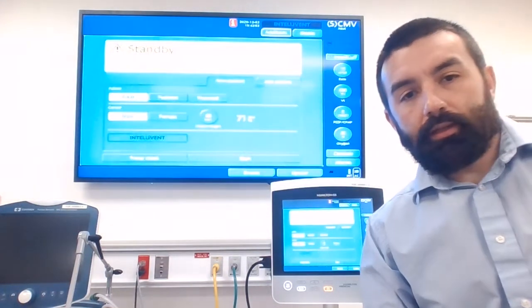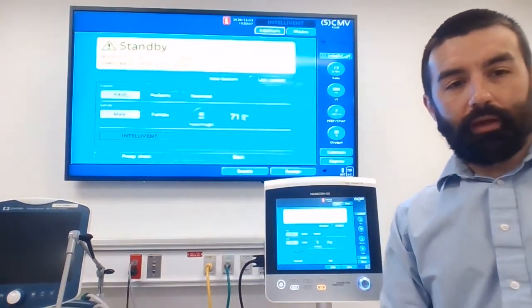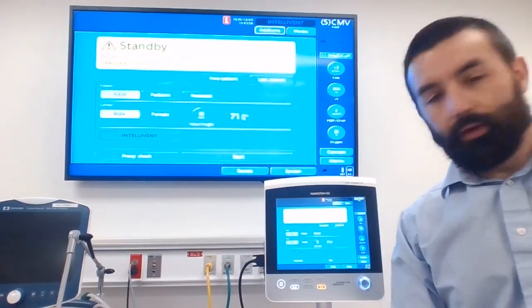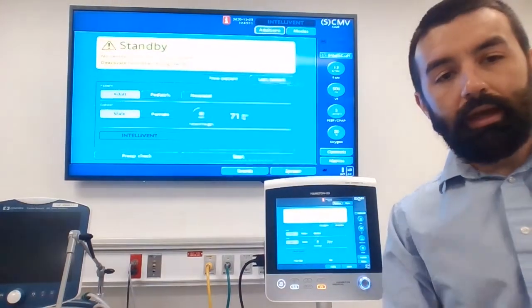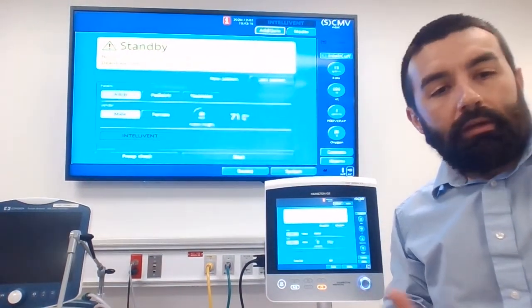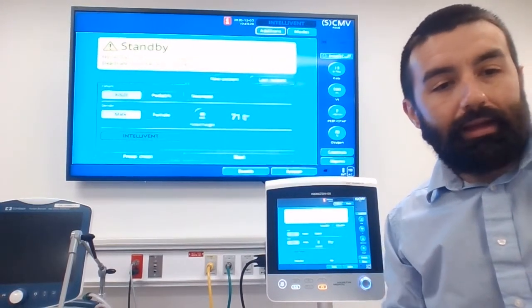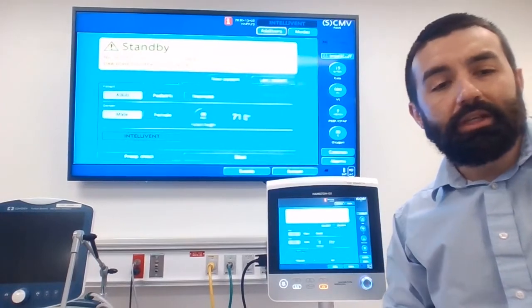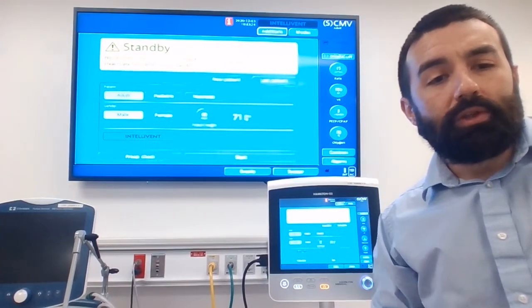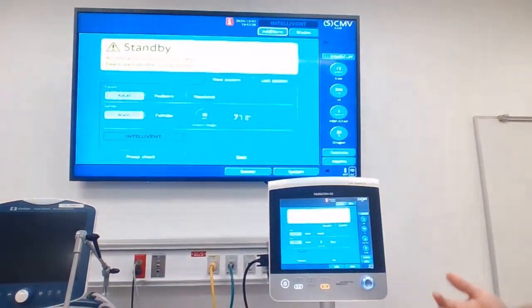Hey guys, I hope that you can see this okay. I've been trying to play with the lighting and bring my computer in from home to shoot this. I'm going to do a quick introduction to ASV, talk a little bit about how ASV works and what exactly it is, and then how to make some basic changes in ASV, as well as how to know what you're doing in regards to ventilator weaning.